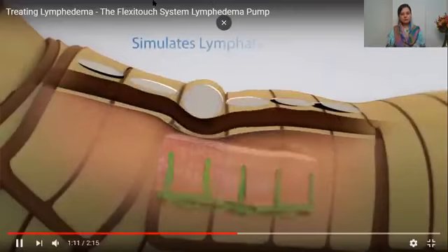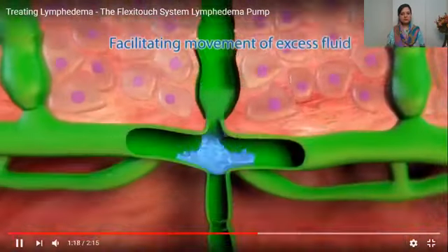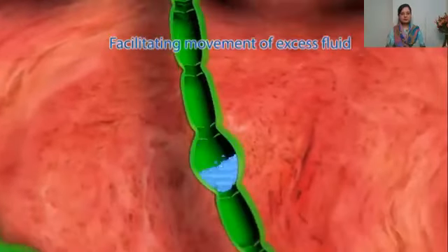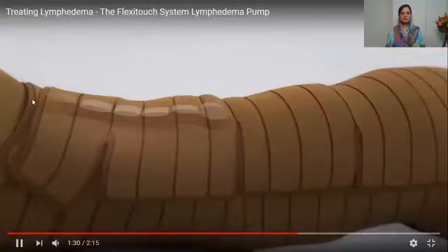Depending on your prescribed garment and program, up to 32 pneumatic chambers sequentially inflate and deflate to apply the correct pressure to the anchoring filaments that attach to the lymph capillaries and cause the capillaries to open and receive lymph fluid. The lymph fluid is then channeled into segments called lymphangions.